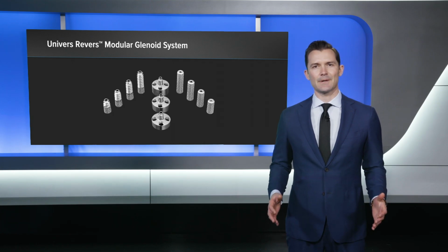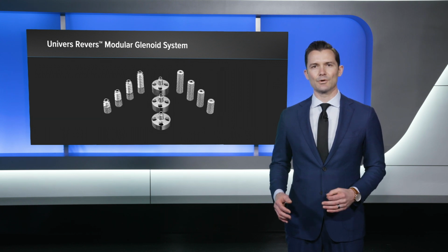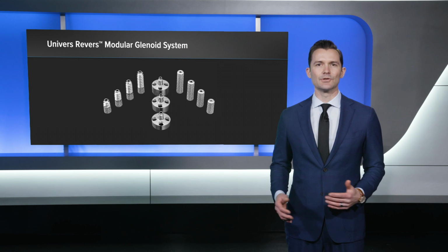What I really appreciate about this system is its versatility. It's truly allowed me to more effectively address a wider array of patient anatomy, including my small patients.